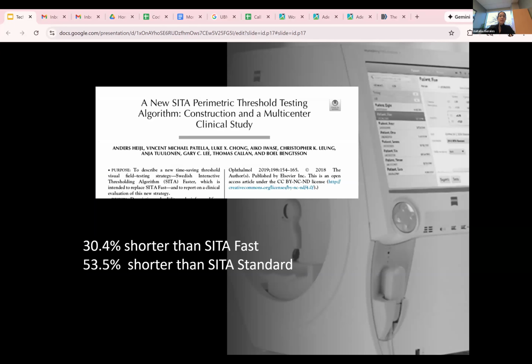Okay, so there are different types of protocols that you can use in visual field testing. There's a full threshold. There's SITA Standard, SITA Fast, SITA Faster. The faster you get, the fewer points that you're testing, and so the less helpful it can be to detect small, subtle changes. But faster testing is also helpful for screening. If you're just trying to grossly say, hey, does someone have changes that we're concerned about? Yes, no. The fast testing can be very helpful for that.